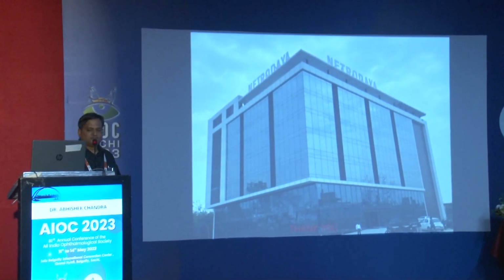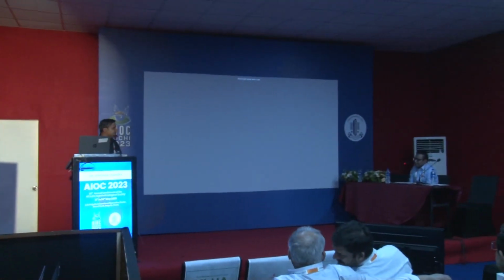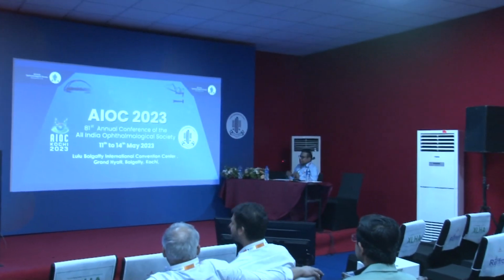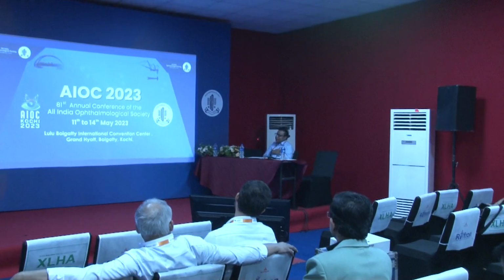Thank you very much. There is a definitive advantage of trans PRK over PRK in that it is a single step process. Yeah. But I prefer PRK over trans PRK because epithelial thickness is not uniform. If you are keeping the epithelial thickness at 60 micron, and you see the epithelial map, it is going from 52 to 62 kind of thing. So if you are applying a uniform laser, just removing the 60 micron, there may be surprise of.